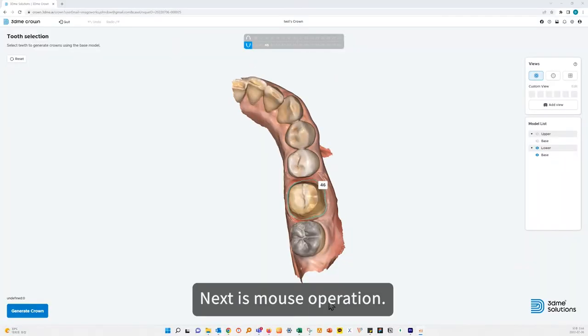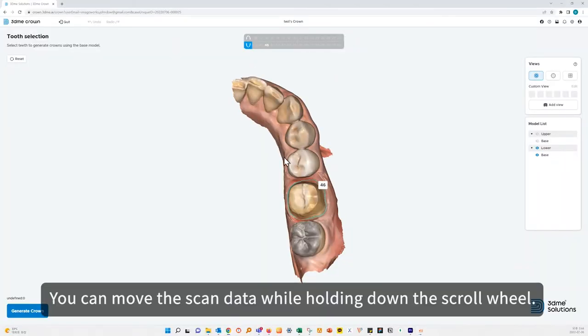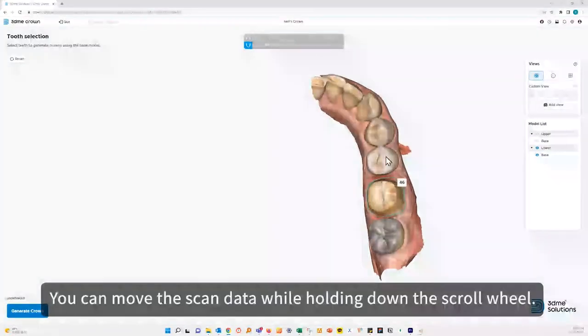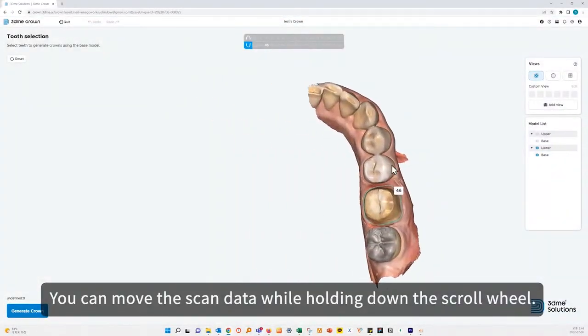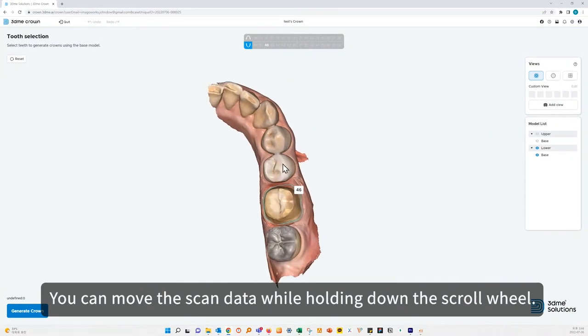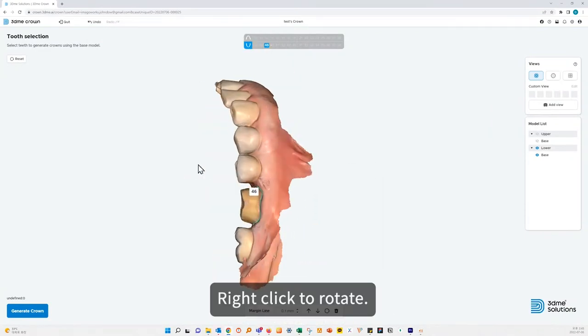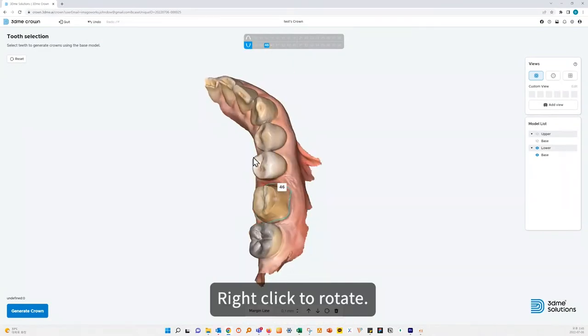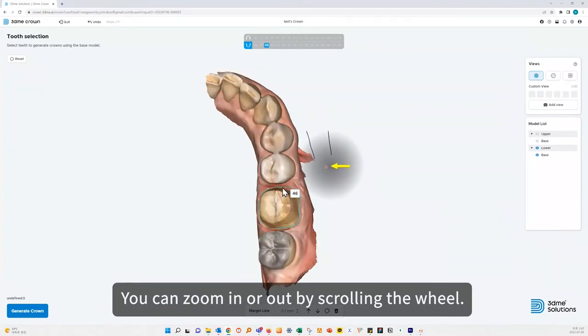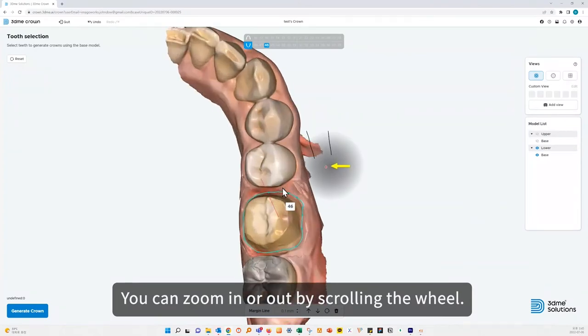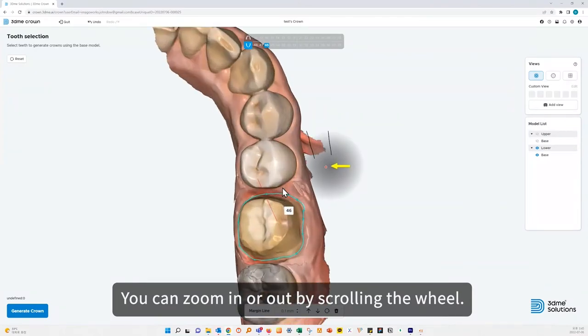Next is mouse operation. You can move the scan data while holding down the scroll wheel. Left click to add or select. Right click to rotate. You can zoom in or out by scrolling the wheel.